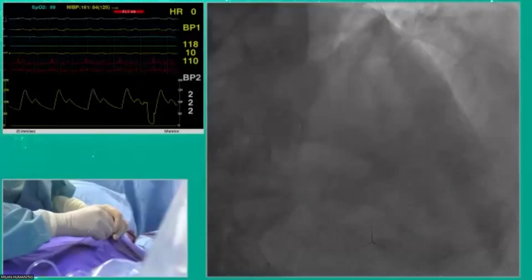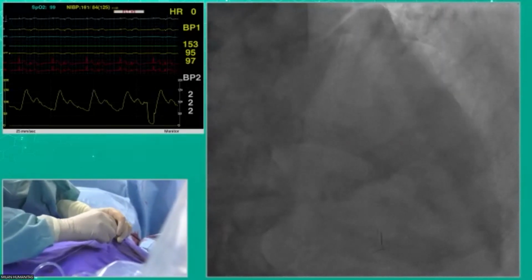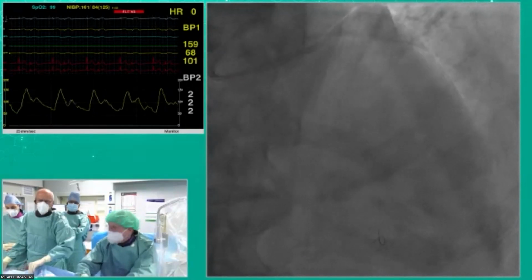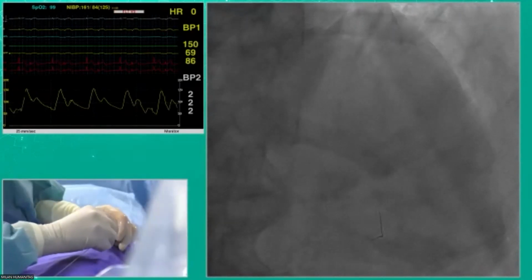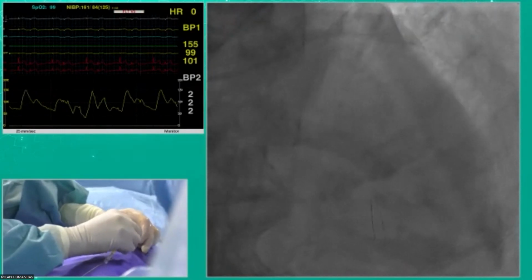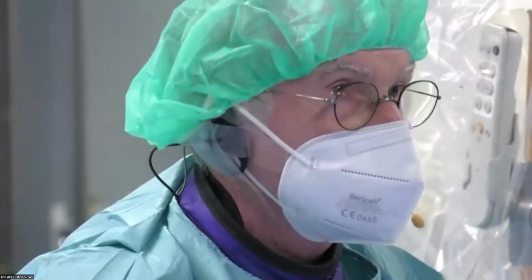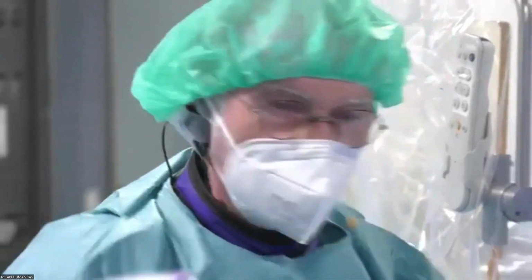What do you think about imaging, and at what point would you consider an IVUS or an OCT here? I do imaging if the angiographic result is so-and-so. I know that Bernard is going to push me to do imaging, and I'll follow. But you ask me the question, I do imaging when the angiographic result is so-and-so. If the angiographic result is good, BMW or Sion? Sion. So do you think you should do an iFR or an FFR, even if the angiographic result is good? If the angiographic result is good, I don't do iFR and FFR.